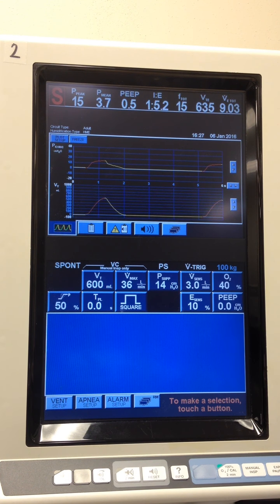And just remember, anytime you have a spontaneous breathing patient, you have apnea set.